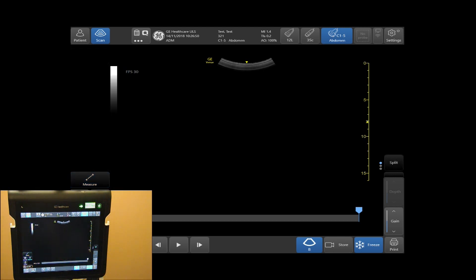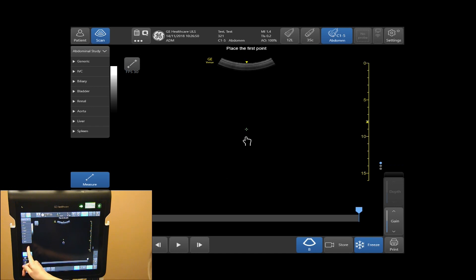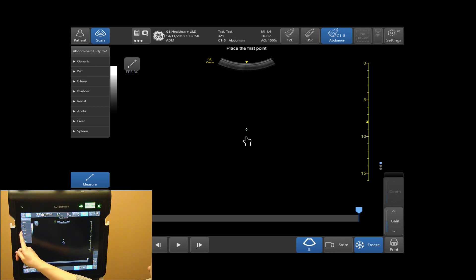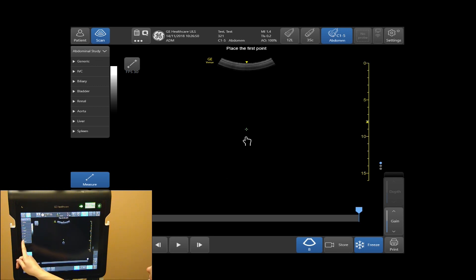To add a measurement into your calc package, tap on your measure tab. Next, you will select from the list of measurements that appear on the left-hand side of your touch screen. Select the measurement that you would like to complete. In this case, I will do a liver length.